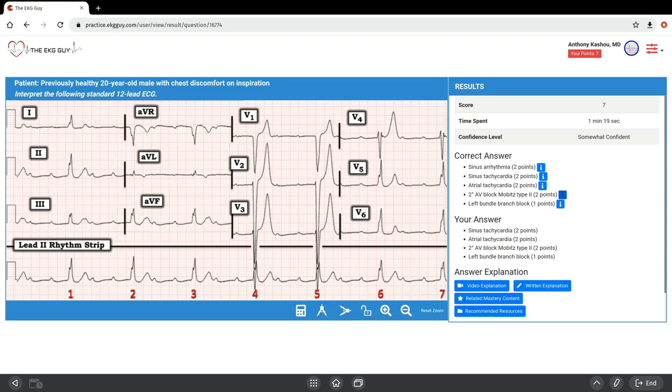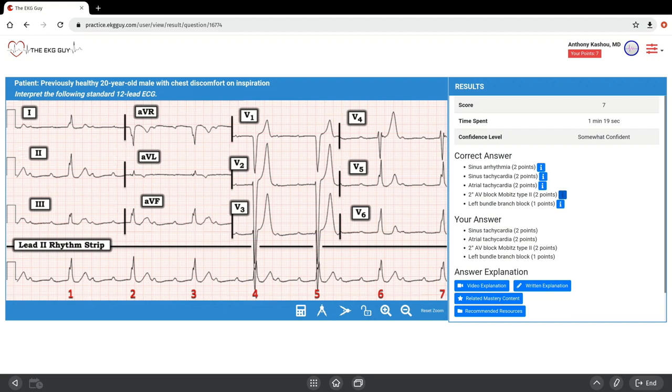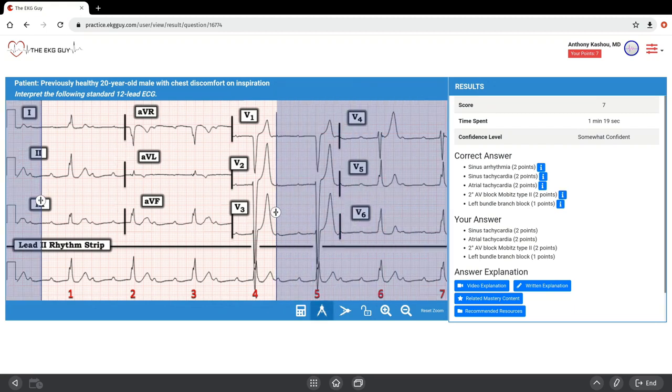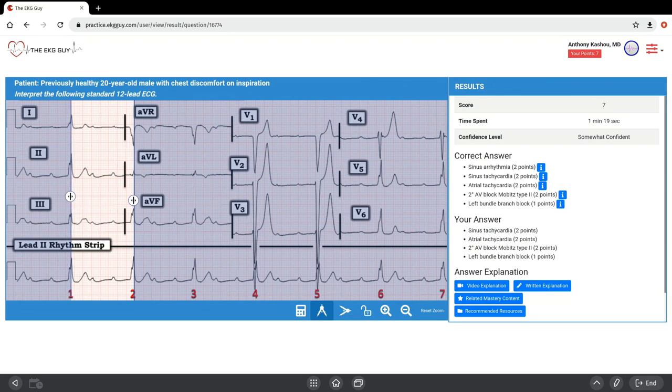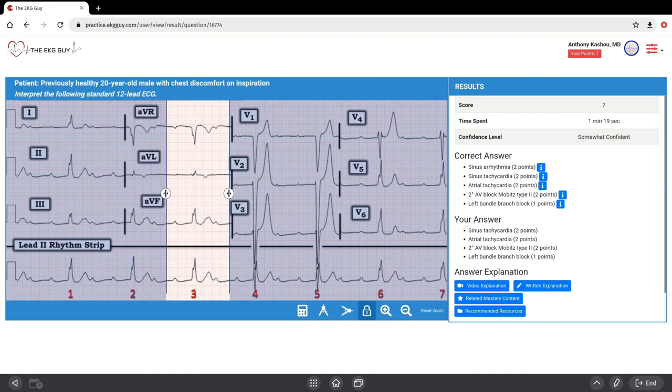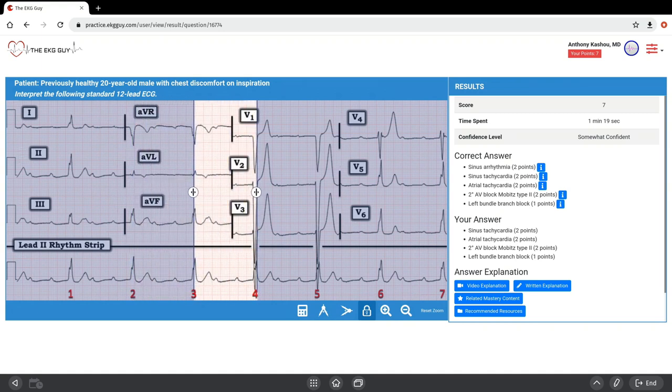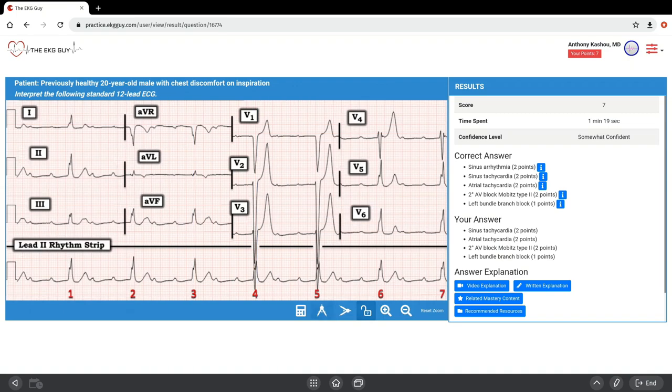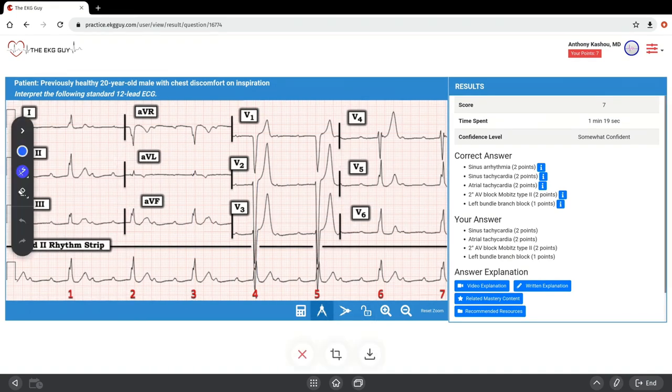Right from the start, this is our 20-year-old male with chest discomfort on inspiration. What we see is a slow, fairly regular, wide QRS complex rhythm with clear P waves present, some of which appear to be non-conducted. If we pull out the calipers and measure the R to R intervals, lock them in place, you can see it's fairly regular throughout. We have some P waves that are non-conducted.